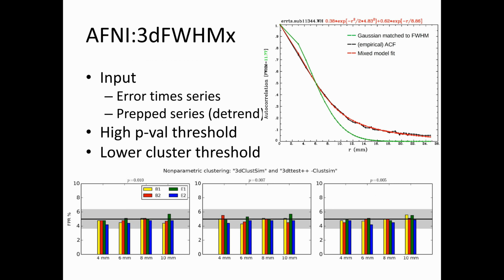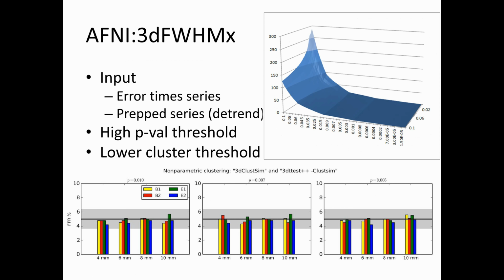So in general, even though this suggests otherwise, I would say you want to stay below 0.05, specifically 0.001 at the voxel level is where you would want to be with your data. And then you can set your cluster level at 0.05. That's fine. But it's really the false positives that you acquire by not setting your p at the voxel level down to a significantly low value.